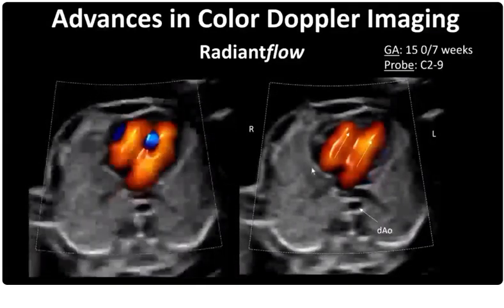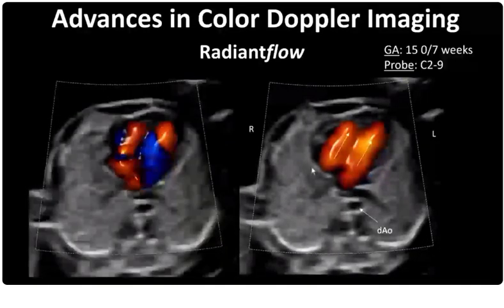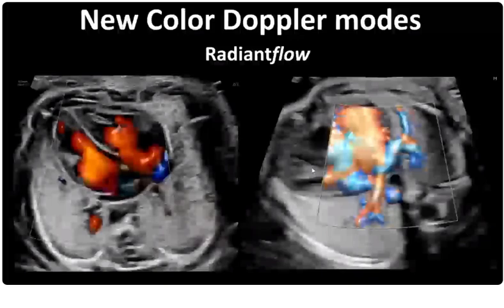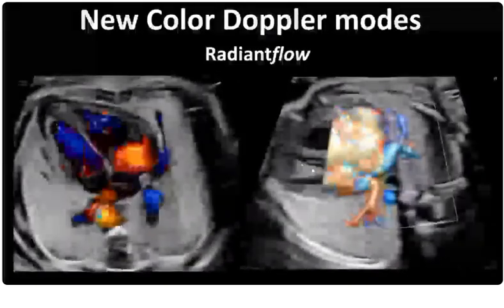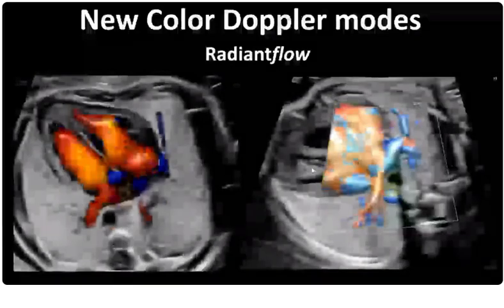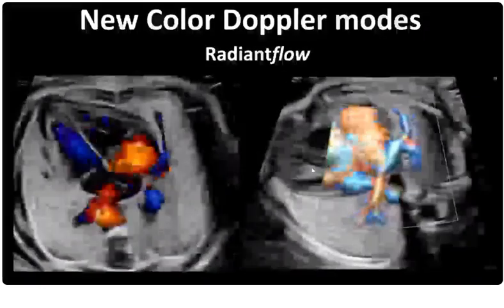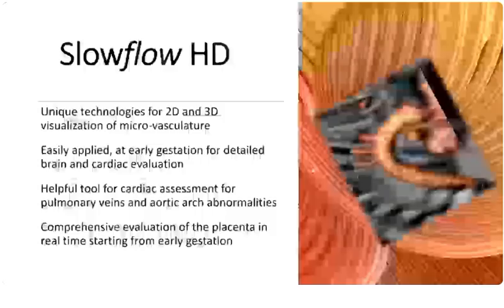You can see how that 3D effect helps to navigate where the interventricular septum is and separate the 2 inflow channels. We can also look not just at the intracardiac flow, but use the HD color modality to assess smaller vessels such as the pulmonary veins.